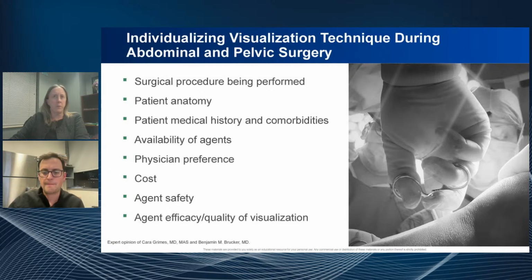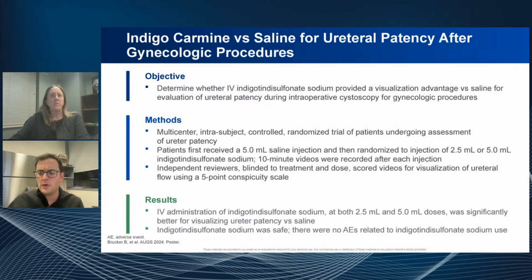Can you expand on that a little bit more? How do you evaluate the efficacy and the quality of visualization? What does that mean? Yeah. I think we all want to know that what we're seeing is actually efflux and it's good. And I will tell you that without fail, if you do the gut check and look at a jet that is blue stained against a normal urine background versus urine against urine, it's much more clear. Yes.